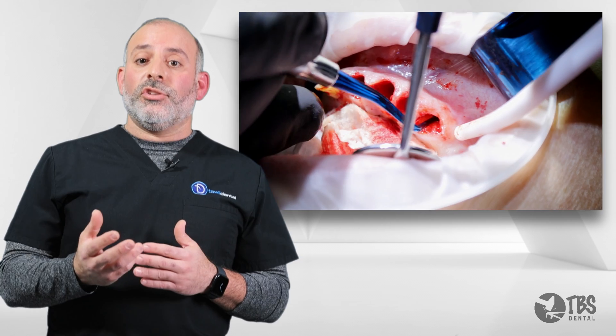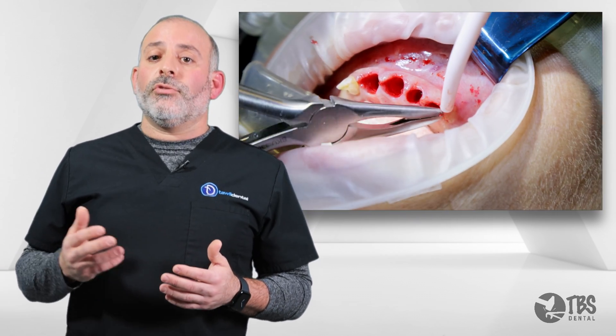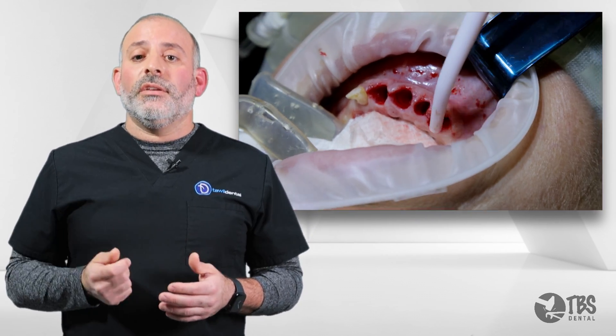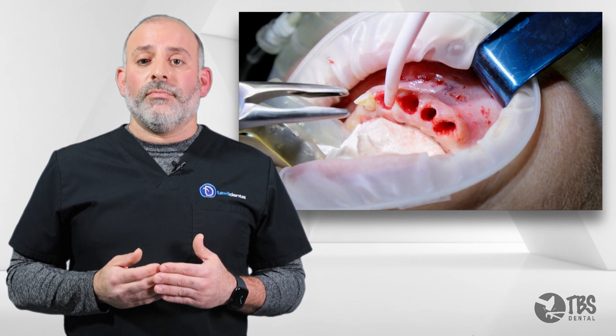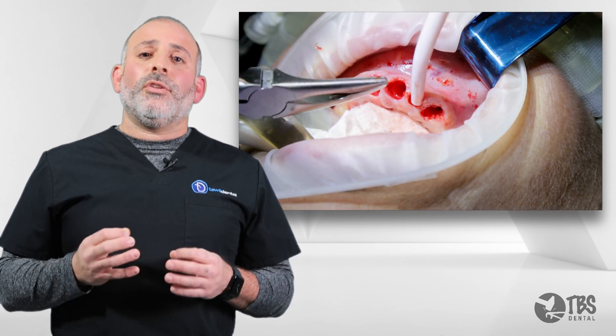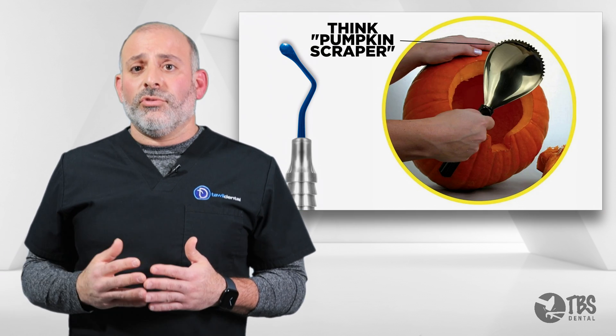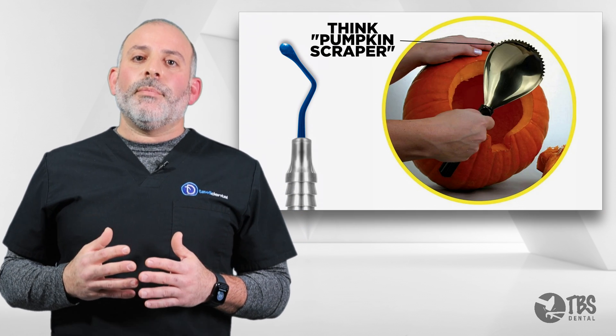Once we have the granulation tissue within reach, we can either use a pair of tissue forceps, hemostats, or rongeurs to easily deliver that granulation tissue. It's paramount for us to be able to clean these sites, because leaving any little bit of infection or any tissue can complicate second surgeries. And the serrated curettes enable us to do so.